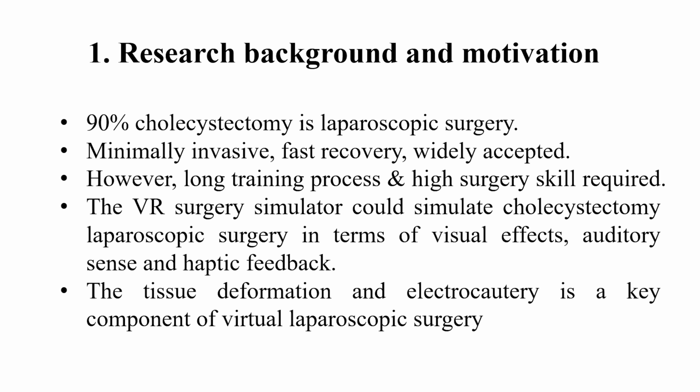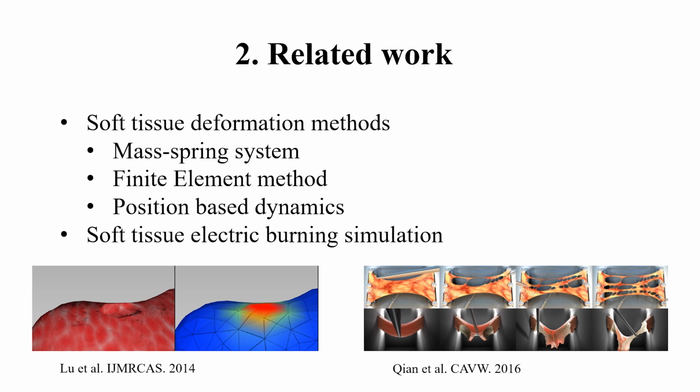Due to the large incidence of cholecystectomy, the application of its VR-based simulation is vital and necessary for the resident's surgical training. In this paper, we present a VR simulation framework based on position-based dynamics, PBD, for cholecystectomy. We investigate a number of soft tissue deformation methods, such as FEM, mass spring model, and PBD. We also study the simulation of electrocautery. Our research aim is to accelerate the deformation of soft tissue on GPU and improve the realism of fat tissue burning.